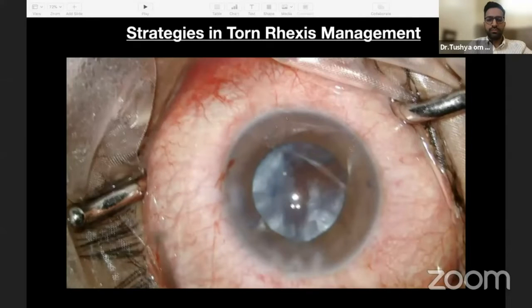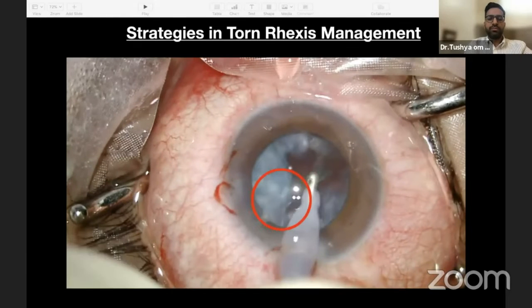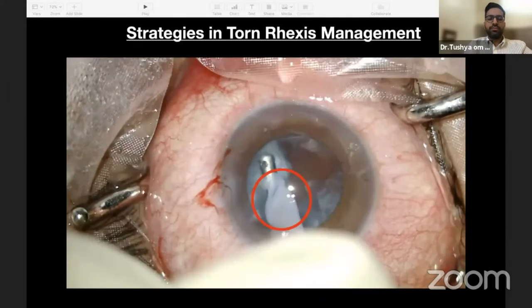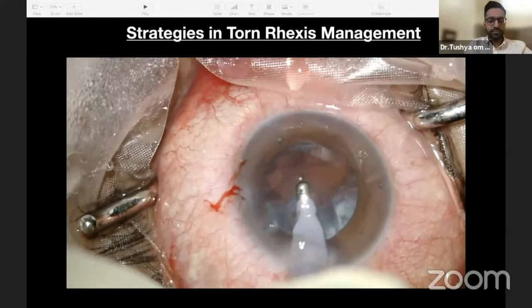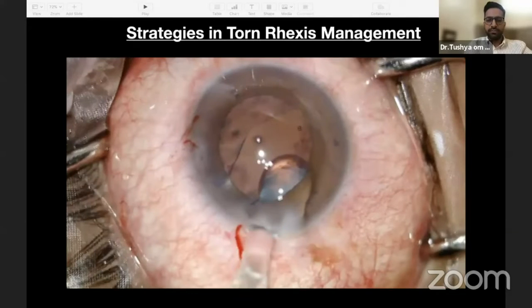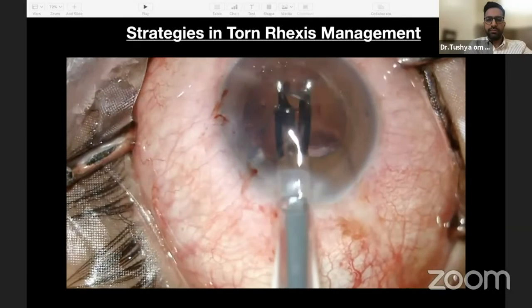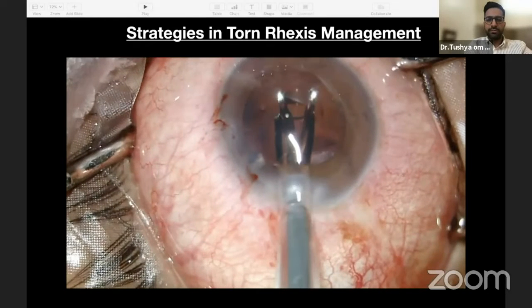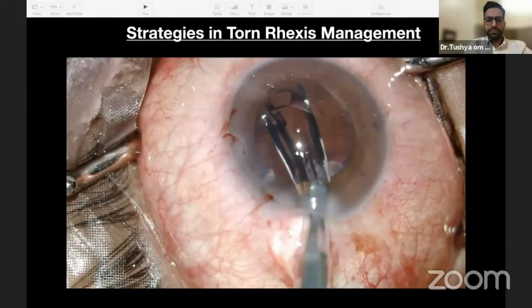Cortical aspiration was done with lower vacuum, with the fluttering of flap tear kept in my visual horizon. I confidently implanted the IOL in the bag as I knew the posterior capsule was intact because of the flap motility sign in my armamentarium. Flap motility.